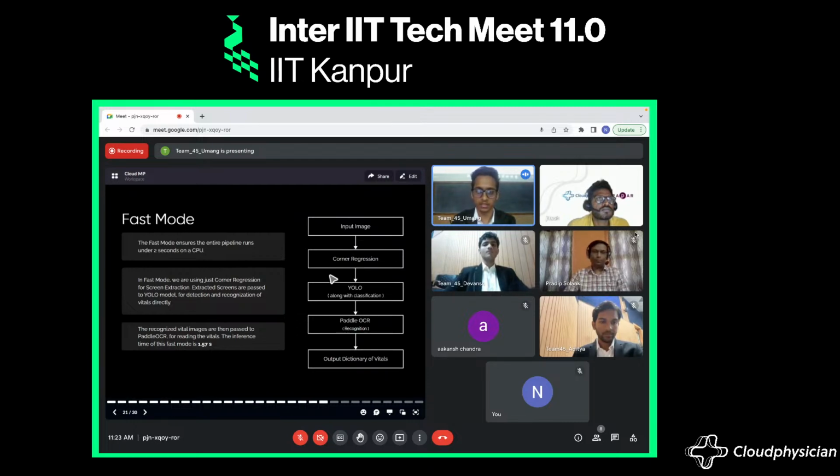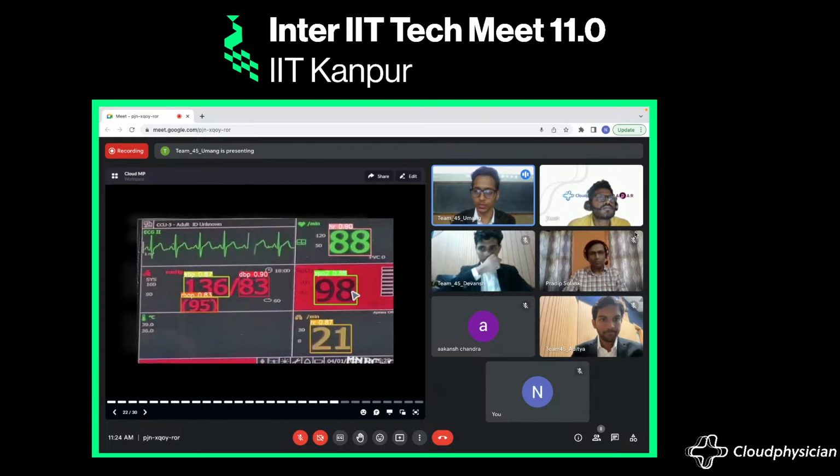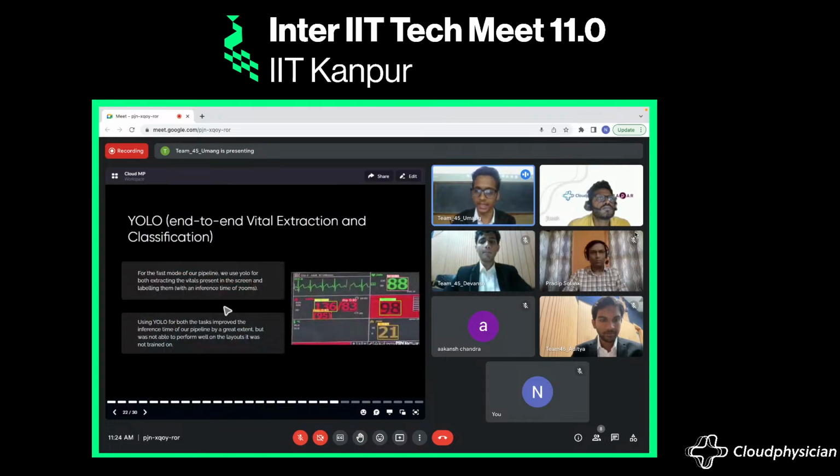The extracted screen is then passed to a YOLO V5 model, which is trained to detect numbers on screen along with assigning them to the respective vitals. These bounding boxes of detected vitals are then passed to a PaddleOCR for recognizing the values inside them, which is then given as the output. Here is an example of the output of YOLO which we trained for our fast mode. This YOLO model improves the inference time to a great extent, but was not able to perform well on unseen layouts, that is, new layouts on which the model wasn't trained.